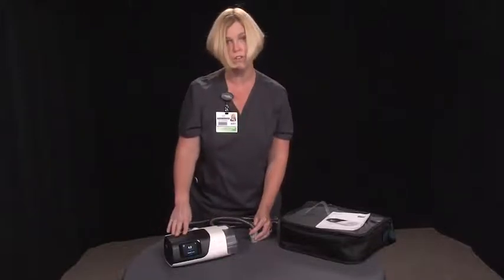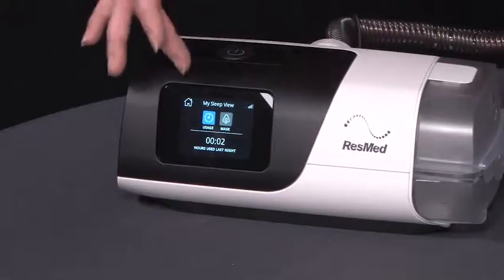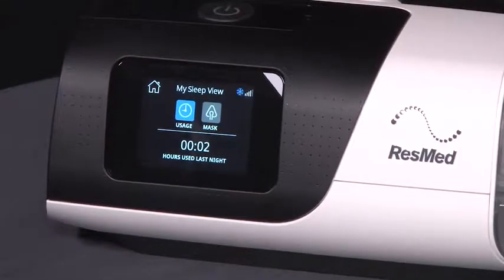When you're done with your therapy for the night, you simply press the button, it turns it off, and it's going to give you this sleep report. It's going to tell you how long you slept with your machine last night.